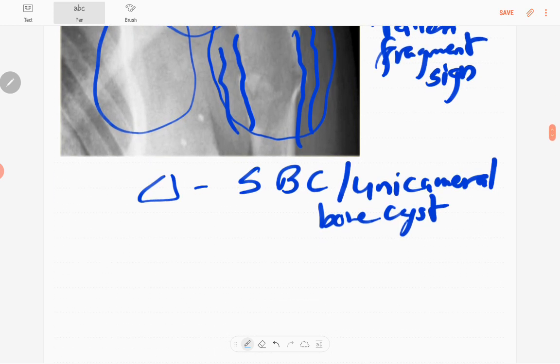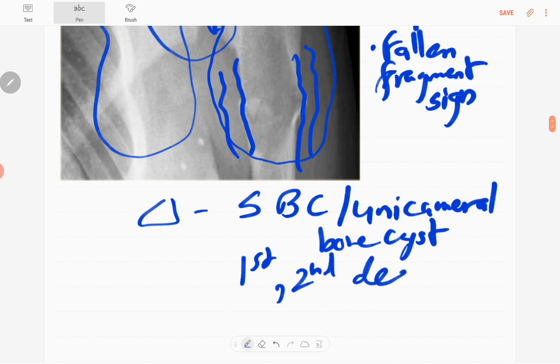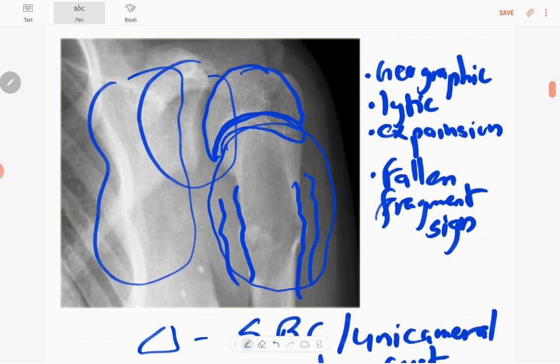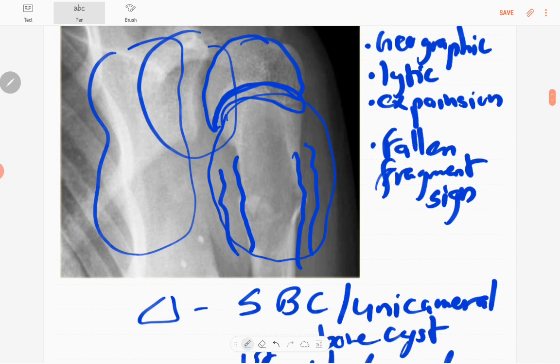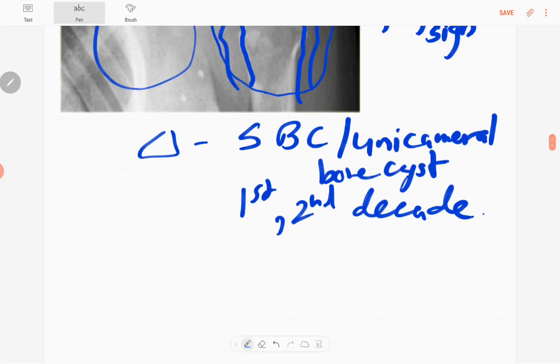Simple bone cyst is common in the first and second decade of life. It is usually a central lesion in the metaphysis, extending into the diaphysis. It is also a unilocular lesion.